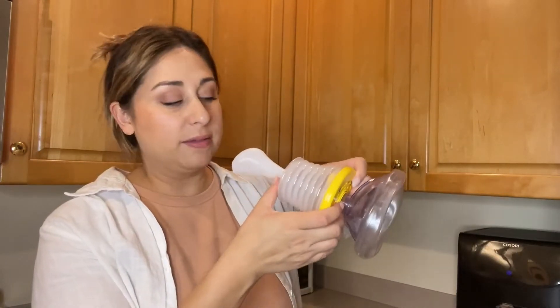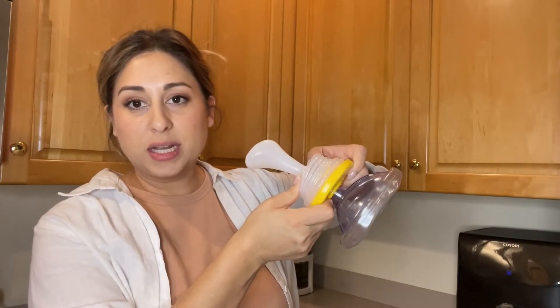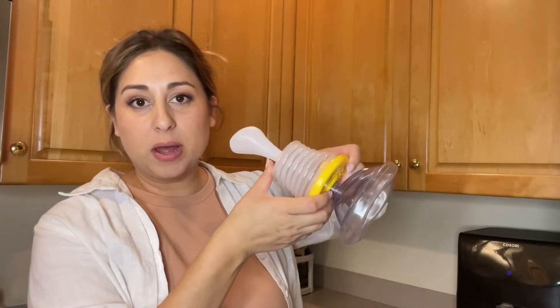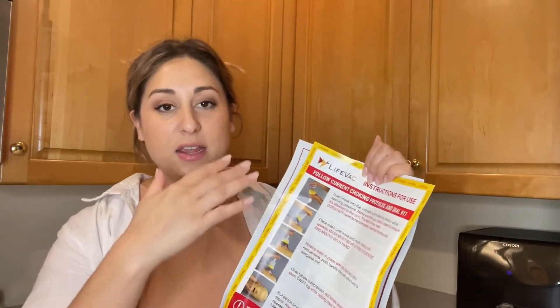This is meant to help you in an emergency if someone is choking. It just uses basic physics — it's going to create a suction and pull the obstruction out like this. You don't have to worry about having any batteries or chargers or anything like that.